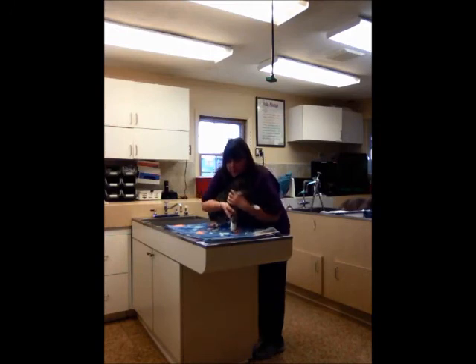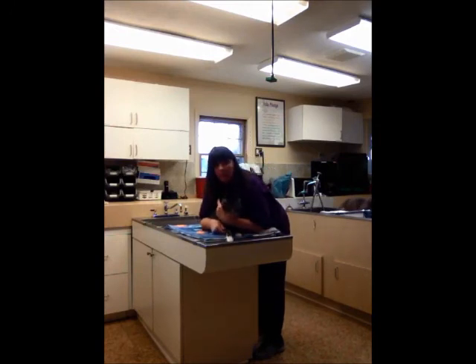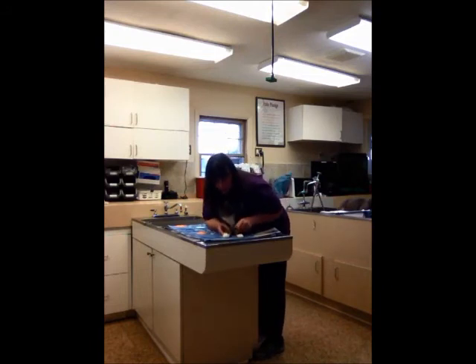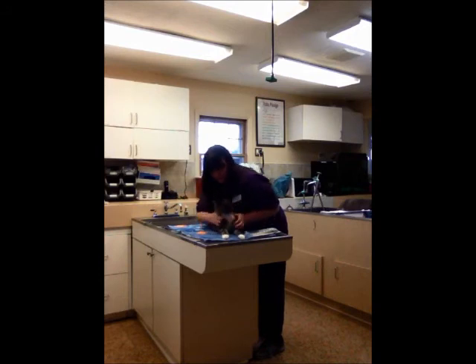For a cephalic draw, you're going to place your hand under his chin, and you're going to take his arm and roll his vein slightly while holding your other middle finger behind his elbow. So this way it is extended, and when they put alcohol or they clip the area, they'll be able to see the vein come up.